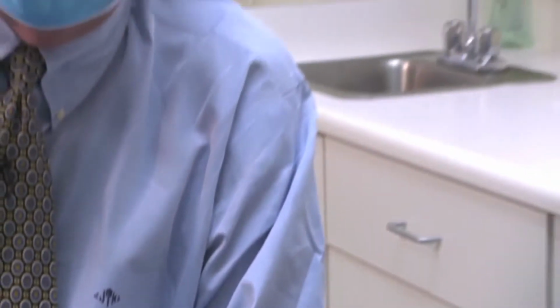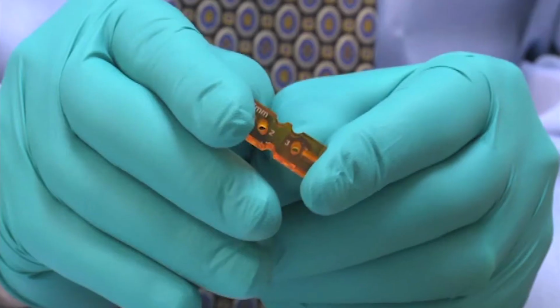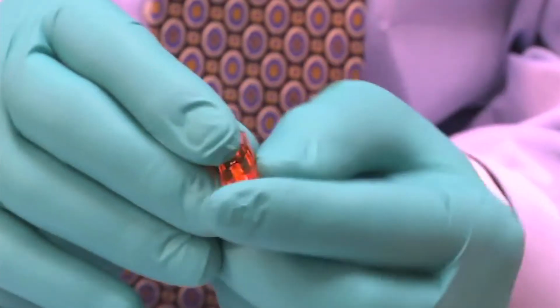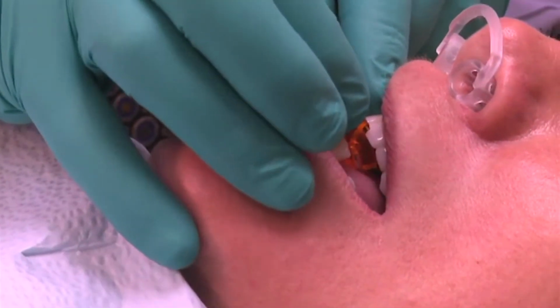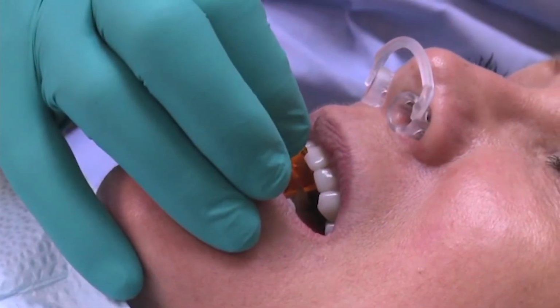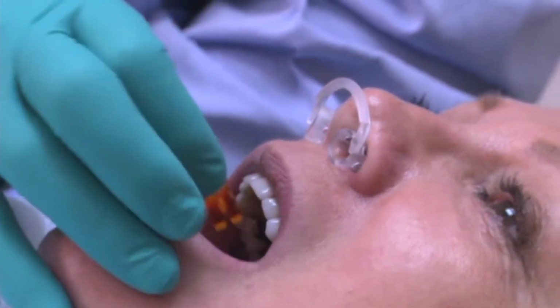So in order to do that, you need to turn the key, and the 3 faces the throat. So to go 3 millimeters horizontal, we turn the key, and the 3 faces the throat. Go ahead and close. Try that now, Kim. So we don't hear a lot of difference between the edge to edge, the 2 or the 3. And open. I would set the appliance and take the bite registration at 6 vertical, edge to edge, because I can always advance the appliance forward.